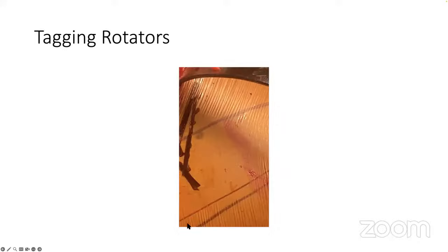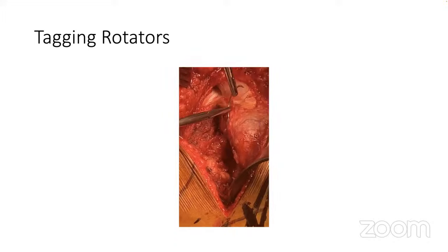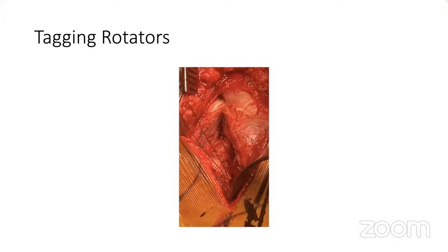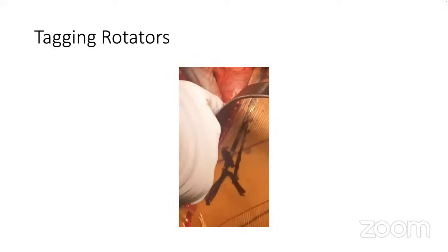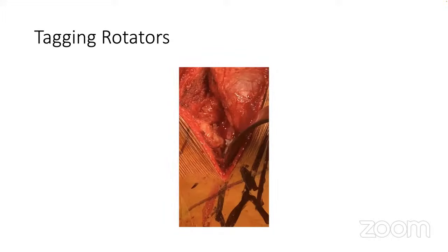The next step is tagging the rotators. I use Ethibond stitches and tag the rotators with the capsular flap — one stitch for the piriformis in capsule and one for the obturator internus in capsule. This helps protect the sciatic nerve when I place my retractors, keeps it out of my field, and also helps a lot during the dislocation and relocation phases so the soft tissue doesn't fall back into the socket. I feel this is an important step.